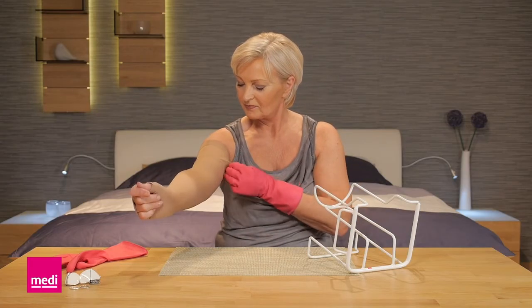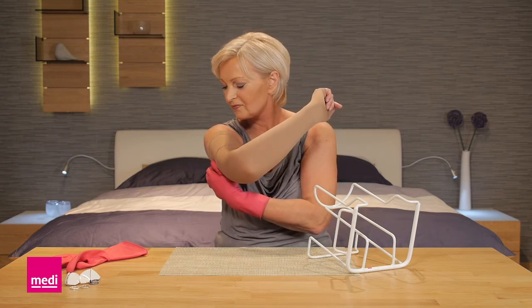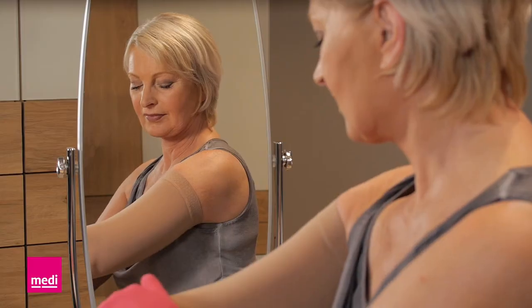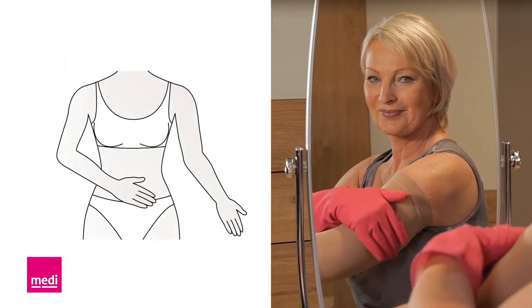Finally, smooth out the material over your whole arm. Depending on the material and length of the arm sleeve, you can push the material back and forth over your arm with the rubber gloves, or grip the arm sleeve with your fingertips, lift it up and reposition it. In conclusion, check that the whole arm sleeve, the elbow and the top band fit properly.